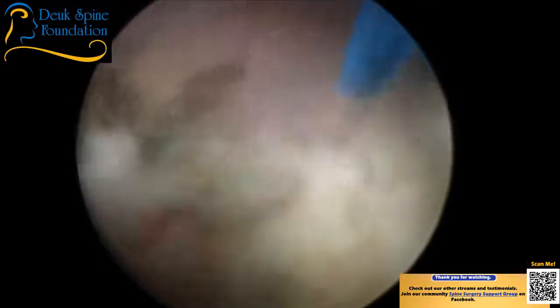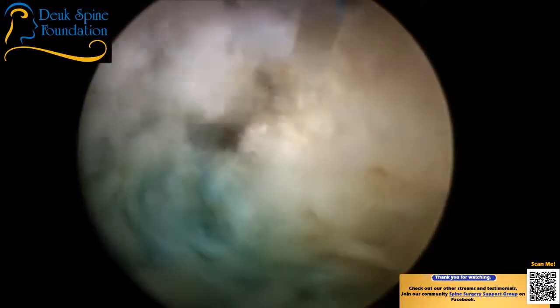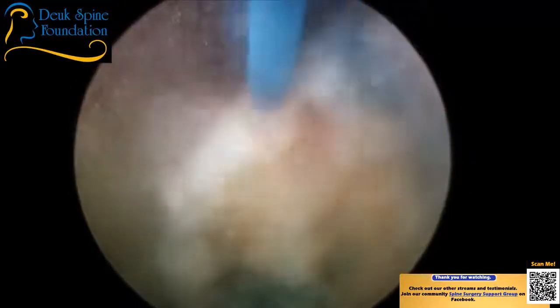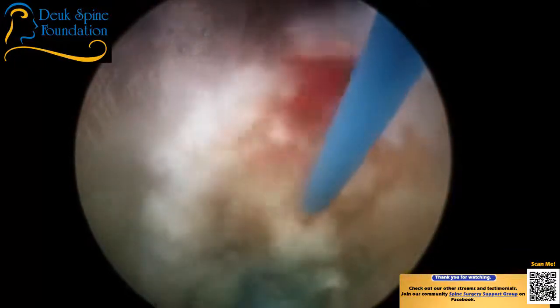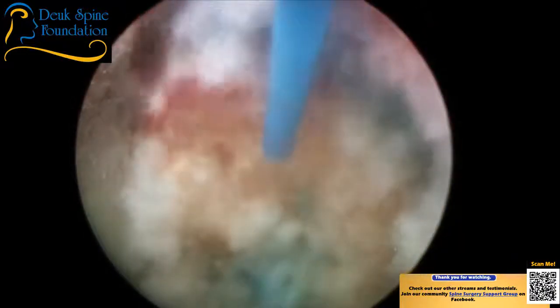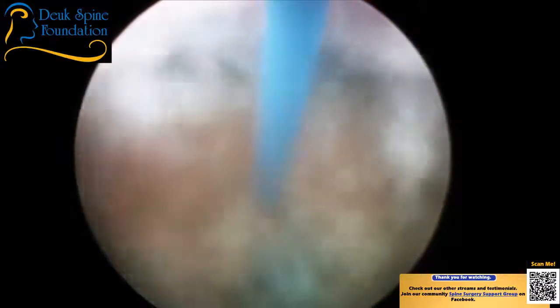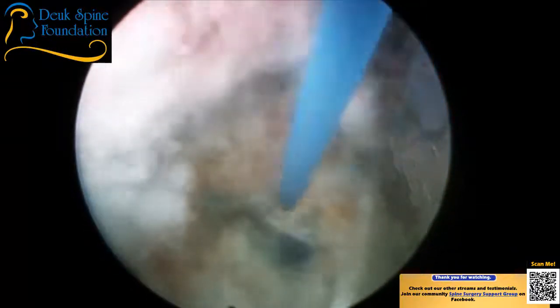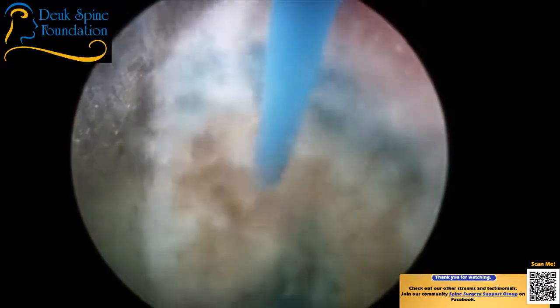A laser malfunction interrupts the procedure — the machine is stopping on its own. Dr. Duke instructs staff to notify the manufacturer immediately, emphasizing the equipment is still under warranty and a technician needs to be sent out. He insists an email be sent with him copied, so there is no dispute about repair costs later. The machine is still functioning but the intermittent stopping is unacceptable.